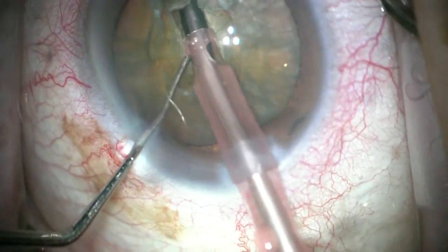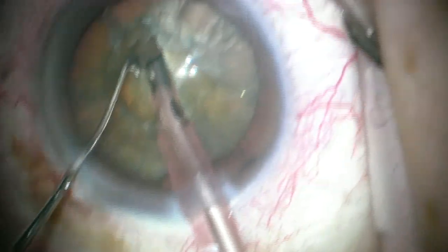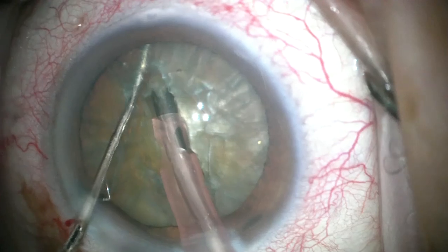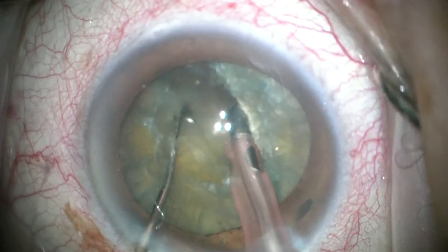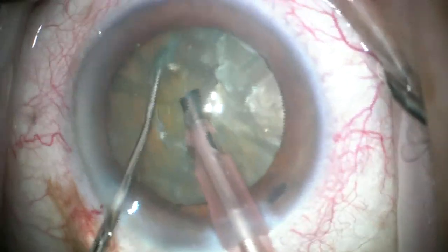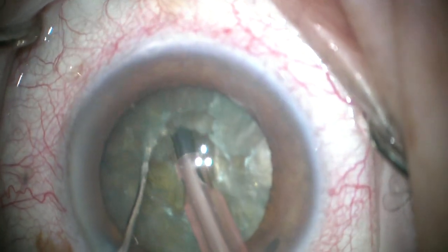I like to have the second instrument in the eye as soon as I start the phacoemulsification. You can see I'm nudging and stabilizing the lens, nudging it a little bit away once we get a trough. I don't necessarily go to the equator with my sculpting. And there's the first fracture — it's only about halfway through — but we can start removing a lens segment with just a partial separation like that if we make a small section to be removed.